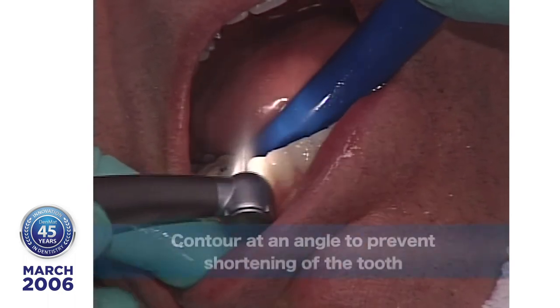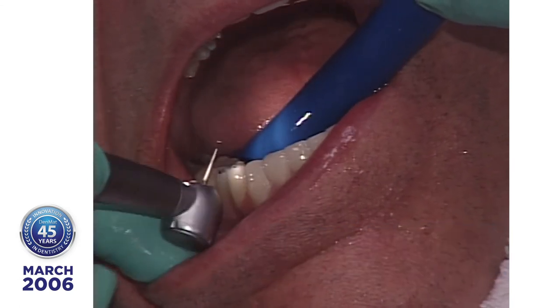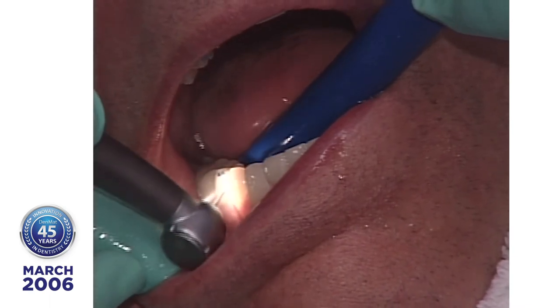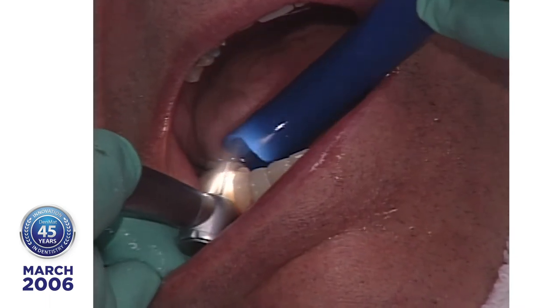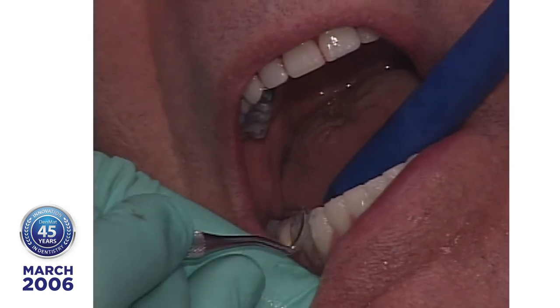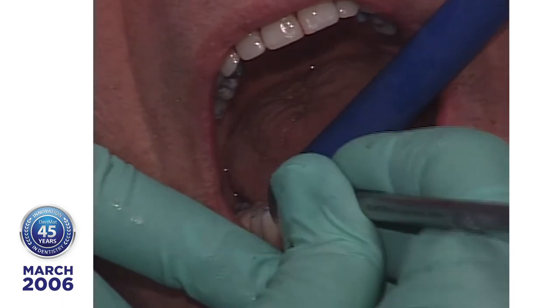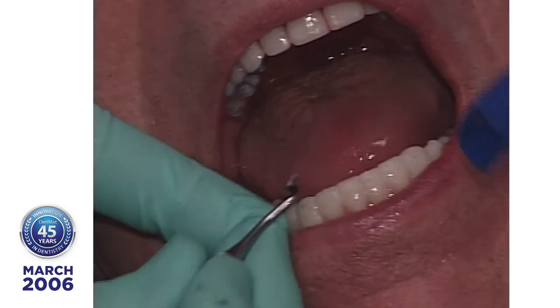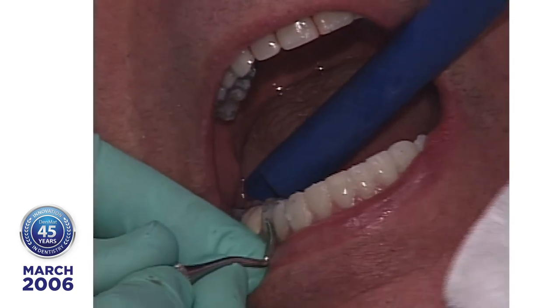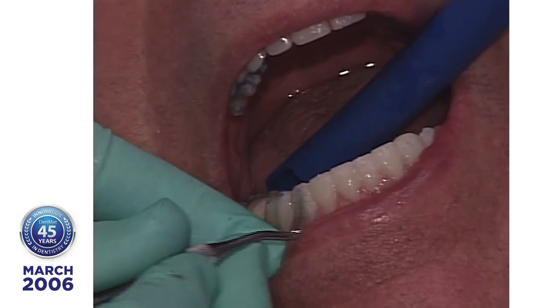Now we've taken off an inclined plane. You don't want to shorten the teeth. You want to go on inclined planes. And I'm sure you all know that it's buccal of the upper and lingual of the lowers that frees everything up. I tell patients that for the first week, they'll have some flaking, but it's not their tooth generally or their porcelain. It's generally the ultrabond coming off, even though it looks tooth-colored.